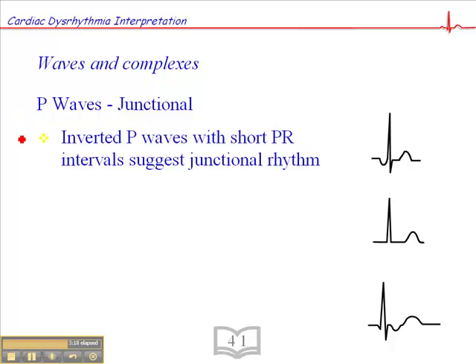But from a paramedic perspective or an emergency medicine perspective, we still often use this term junctional. So if you see inverted P-Waves with a short PR interval, this would suggest a junctional rhythm.